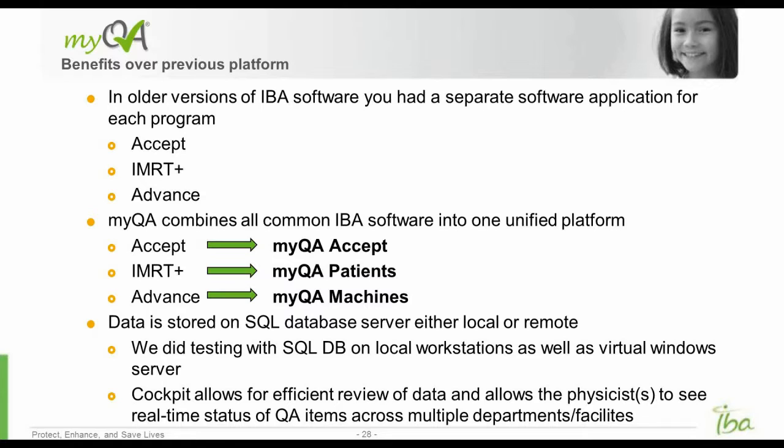No issues with that. We went a little further with our testing. We tested with the SQL server installed on local machines, on desktops and laptops, and finally, the last place we tried was installed on a virtual Windows 2008 server. We installed SQL on a box that doesn't even exist except as a virtual machine, and we found no database connection issues. Everything we tried connected up, you're able to access your data and your devices, and it works really nicely.